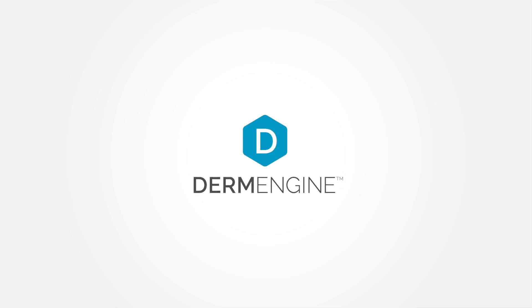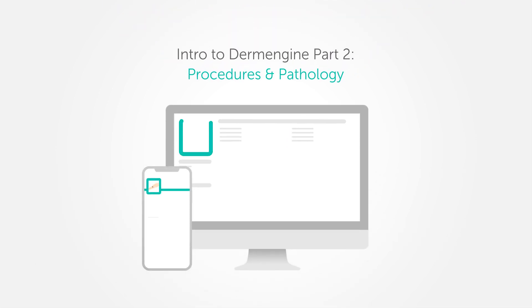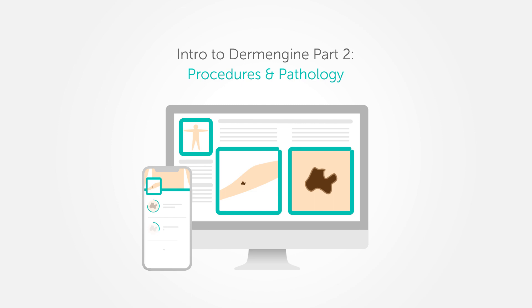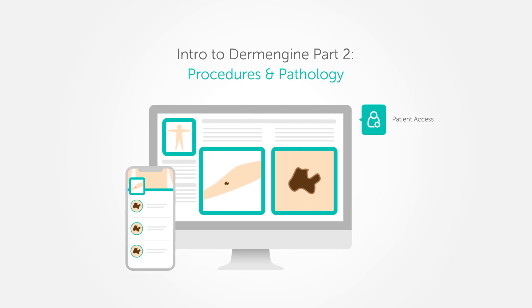Welcome back to DermEngine. In this quick start guide, I'll be showing you additional features like adjusting your patient access settings, documenting a procedure, and navigating the pathology inbox.